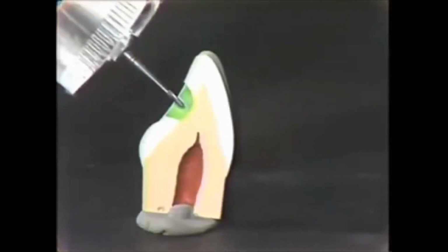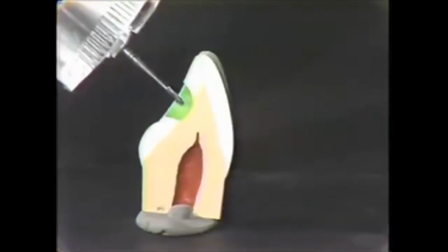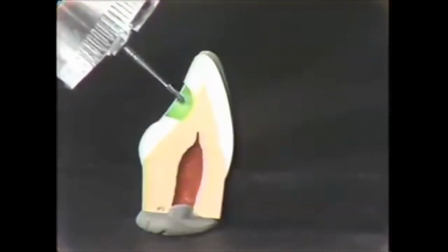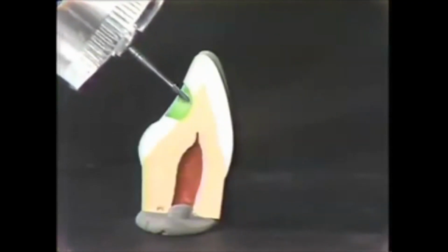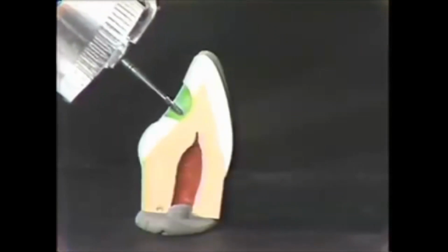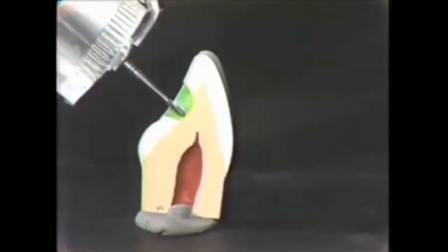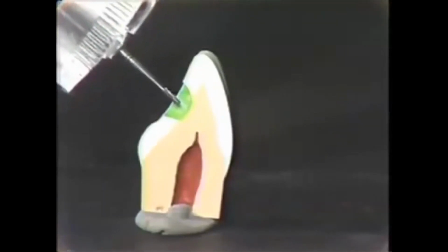You hold the burr at right angles to the tooth surface so that it won't skip across the enamel and gouge the tooth, and also so that you can form nice right angle margins if you're going to restore this tooth in acrylic. Once you've reached the level of the dentin, you can put your high speed aside because you're done with it.